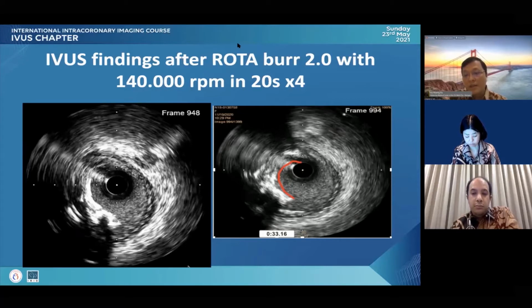For example, with a patient with very low ejection fraction, for the very high risk patient, we put in a temporary pacemaker. For this patient, the EF is okay, everything is okay, so we never use a temporary pacemaker in this patient.